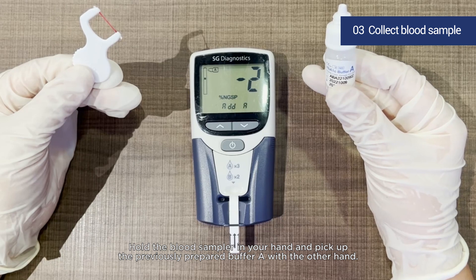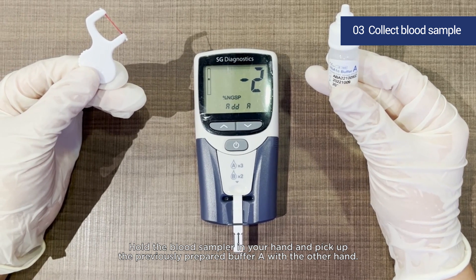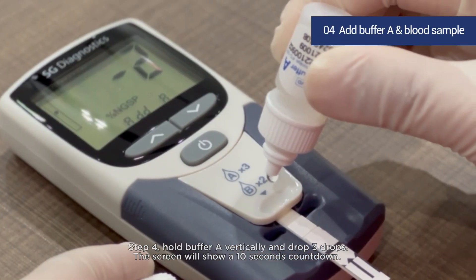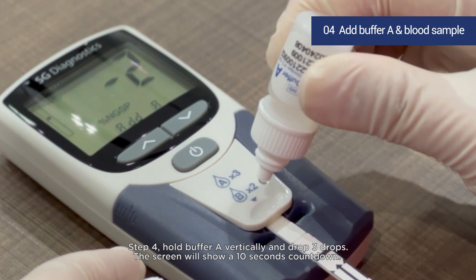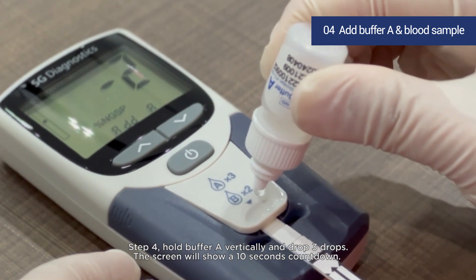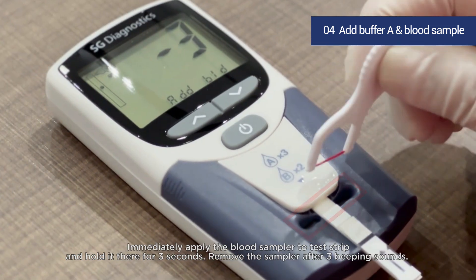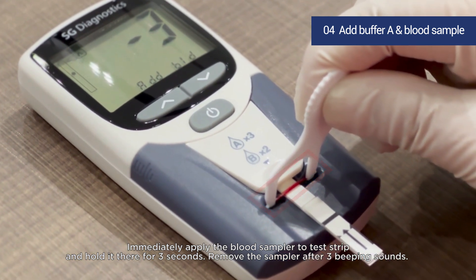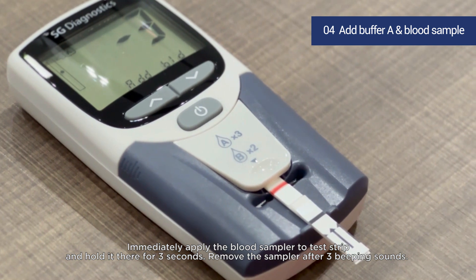Hold the blood sampler in your hand and pick up the previously prepared buffer A with the other hand. Step 4: Hold buffer A vertically and drop 3 drops. The screen will show a 10-second countdown. Immediately apply the blood sampler to the test strip and hold it there for 3 seconds. Remove the sampler after 3 beeping sounds.